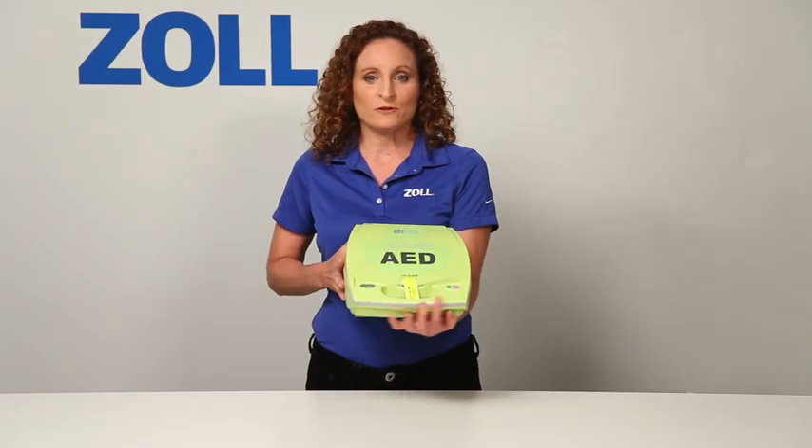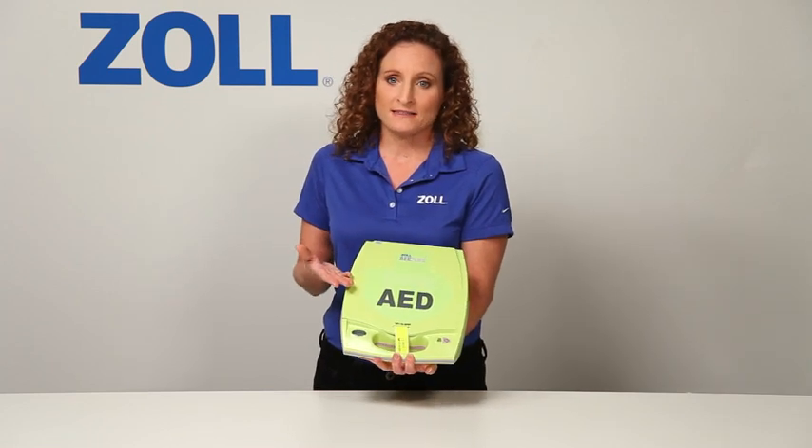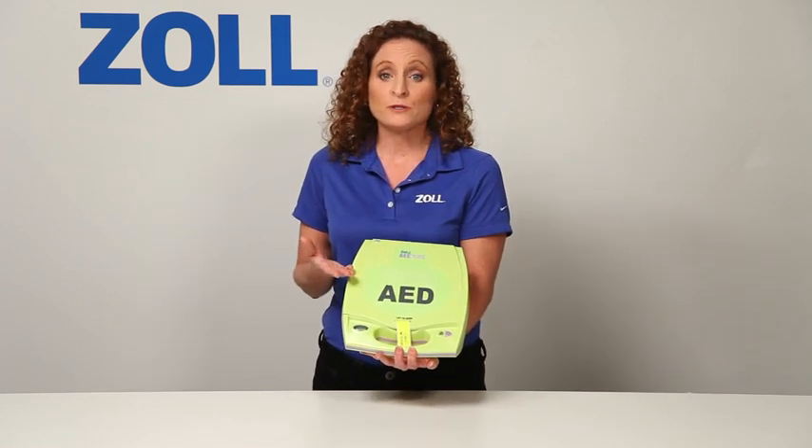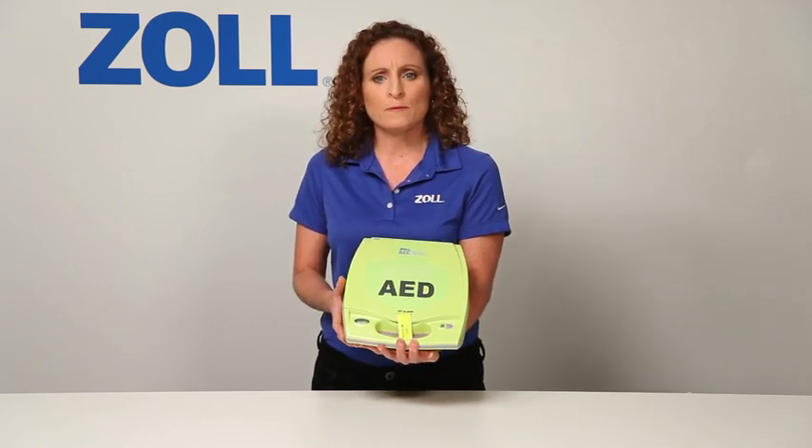Hello, I'm Leslie Zola from Zoll Medical, and this is the AED Plus. An AED that helps you all the time, in every rescue. But don't most AEDs help all the time?